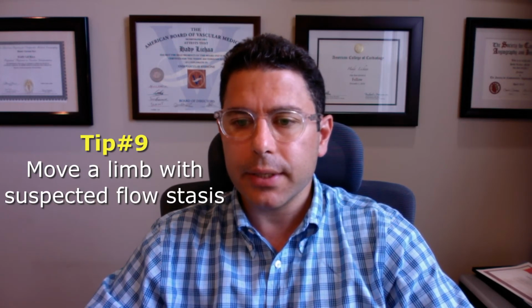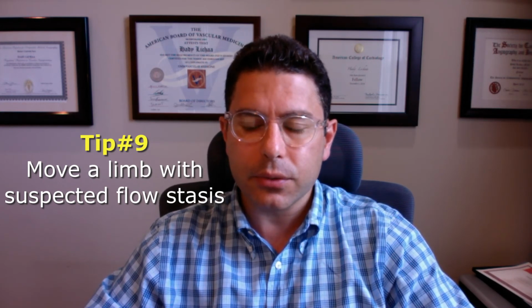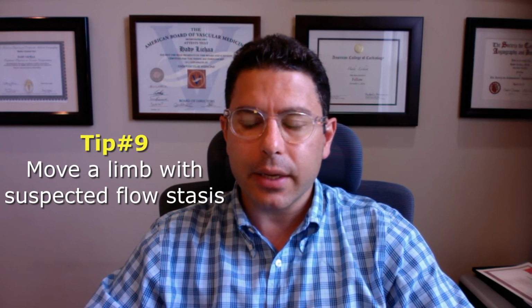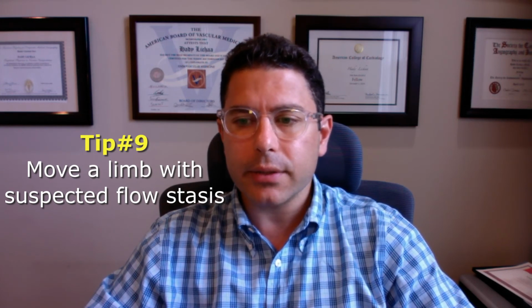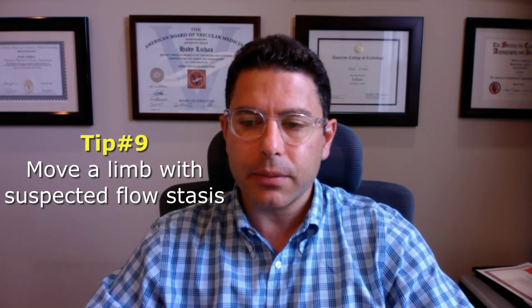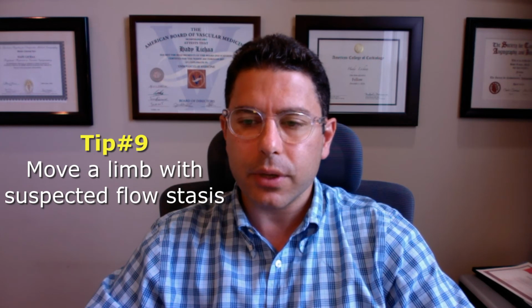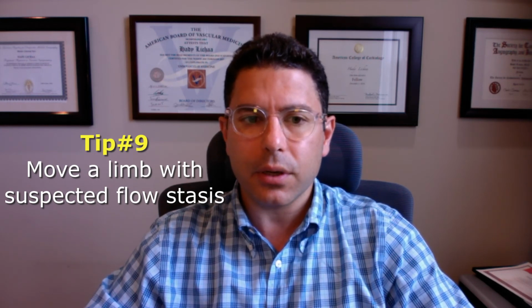And number 9, because the CO2 has a tendency to stagnate in areas of ischemia, when you're going on with the case and it's getting prolonged, make sure you move the limbs in different directions to try to dissipate any potential CO2 bubbles that are trapped in your outflow.